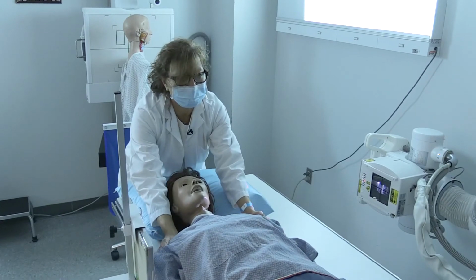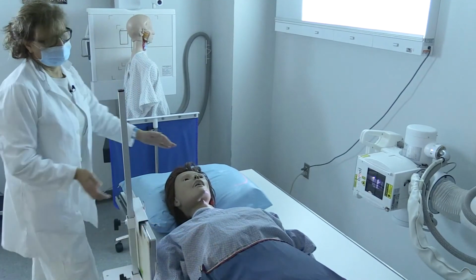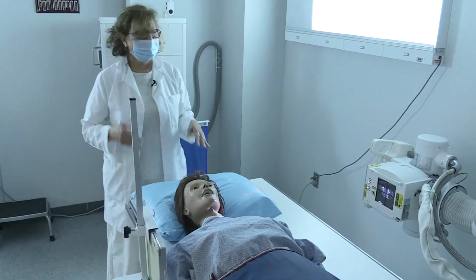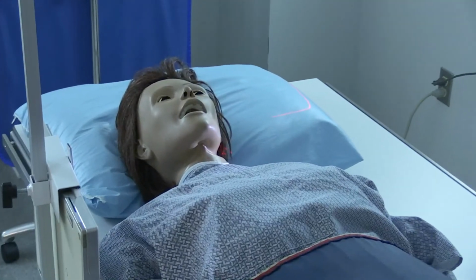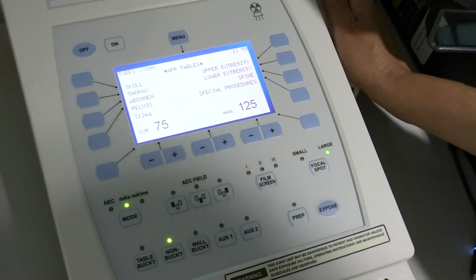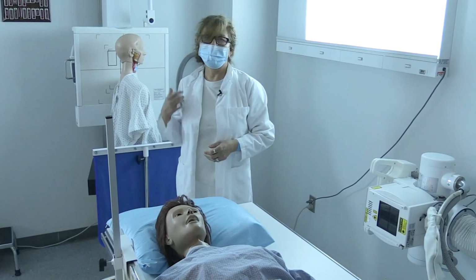Again, make sure the patient's shoulders are relaxed. You have a shield. The head is nice and straight. And then you'd ask the patient again, take a deep breath in, blow it all the way out, hold your breath, and you can breathe. And that's it for cross table lateral C-spine and lateral C-spine.